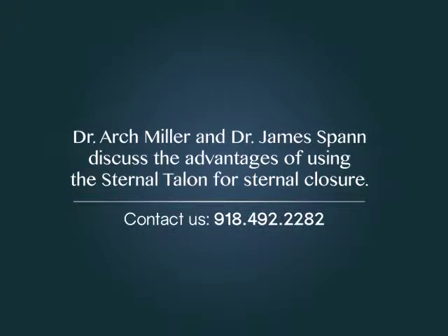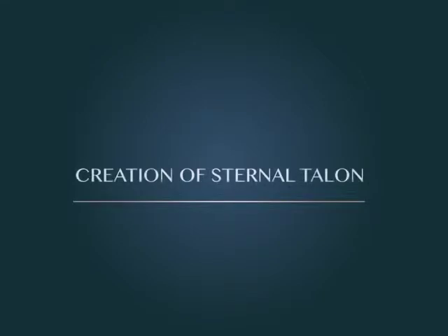Talking about chest wall reconstruction today, including the Talon and some work we've done with creating new ribs that we call Neoribs. Talon is basically an instrument that is responsible for pulling the bones together after they've been separated for cardiac surgery.